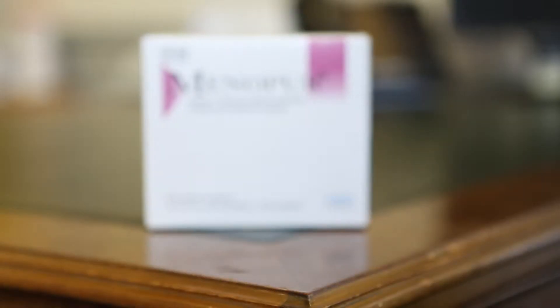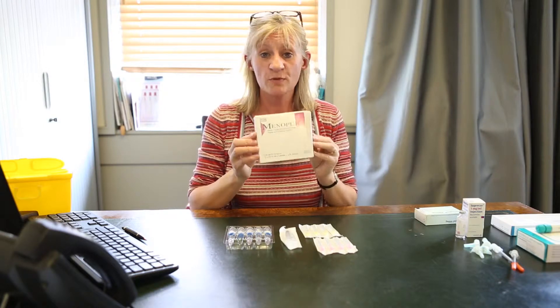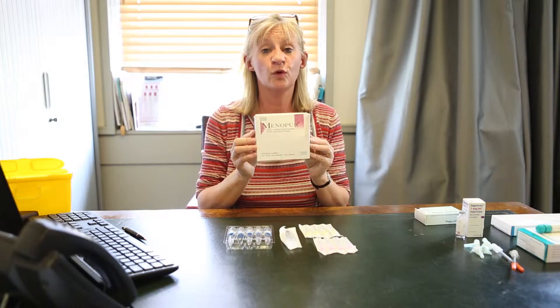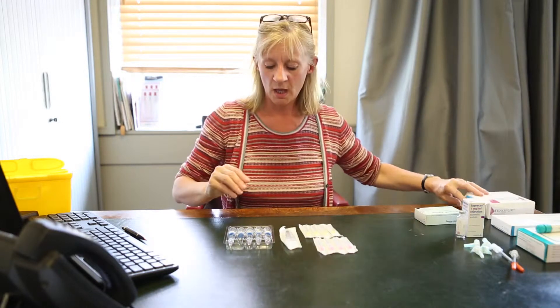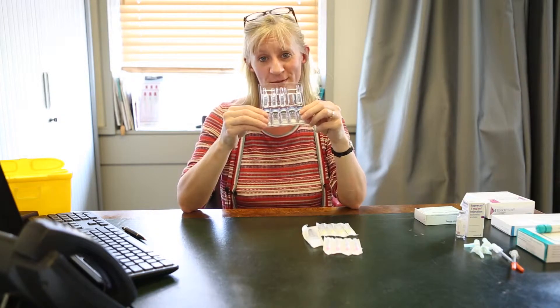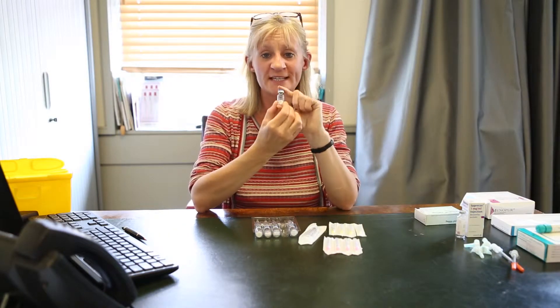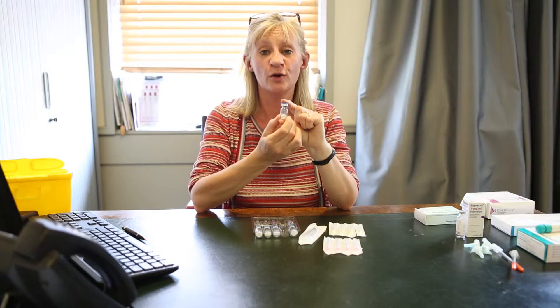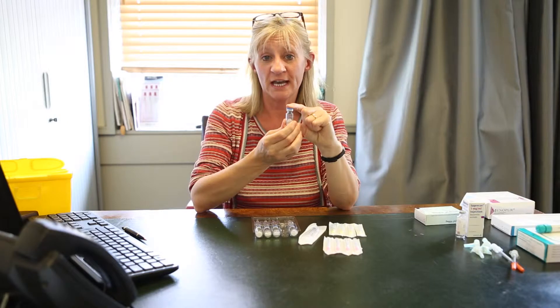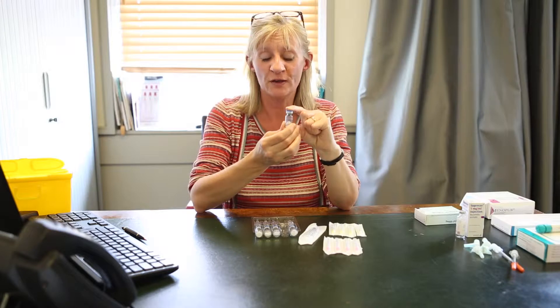I'm now going to show you how to use the drug Menopur. Some women are given Menopur, some women are given Gonal-F. There is very little difference between the two of them and your consultant would have given you the one that's going to suit you the best. Menopur comes in powders and liquids. Each of these powders contains specifically 75 IU of FSH. You will be given a set dose that you need to take — this may be 150, maybe 225, depending on how you may respond.